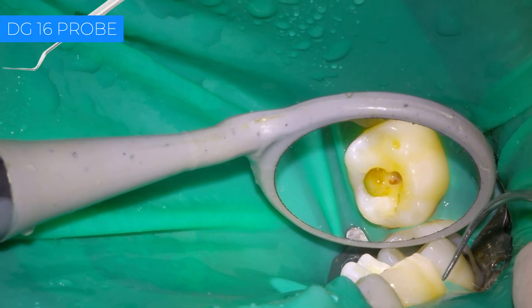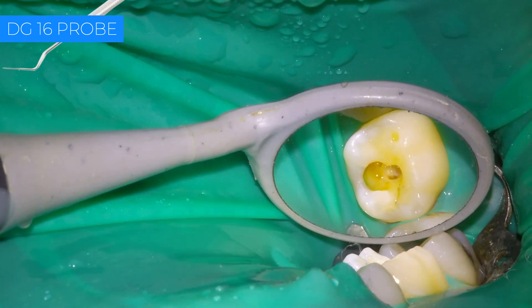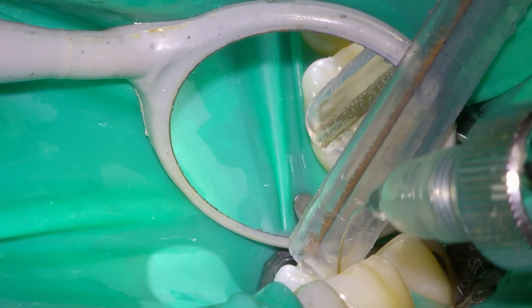Here we can see bleeding and we use the DG16 probe to confirm the existence of the root canal. In this case it is the distal canal.